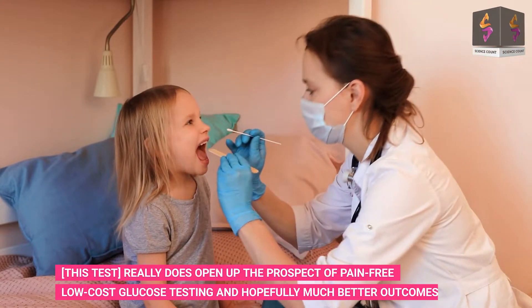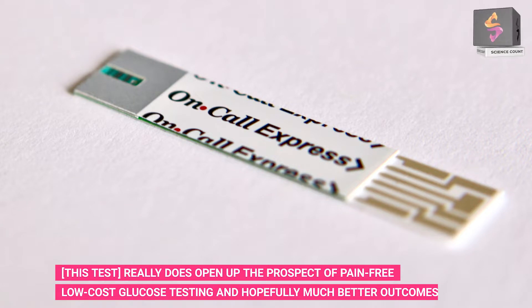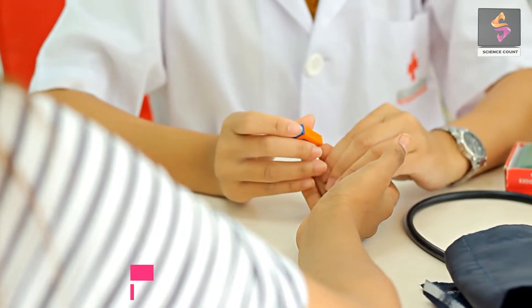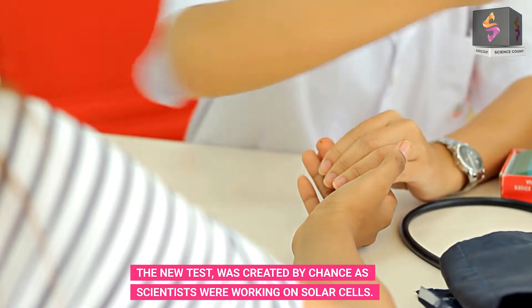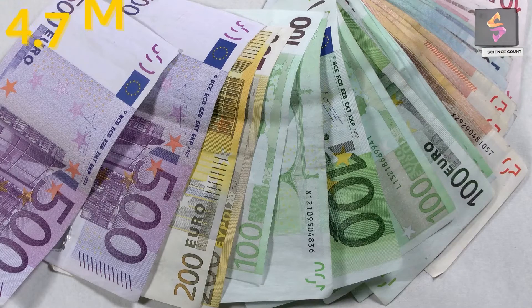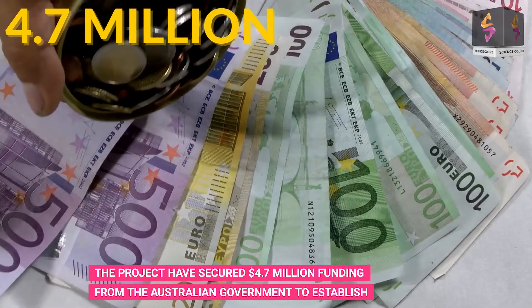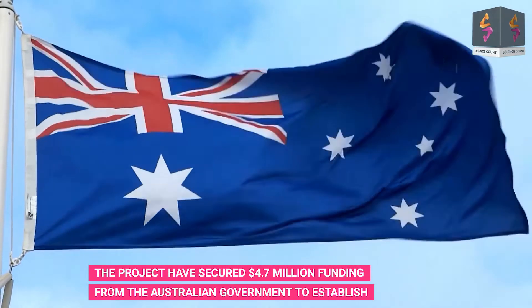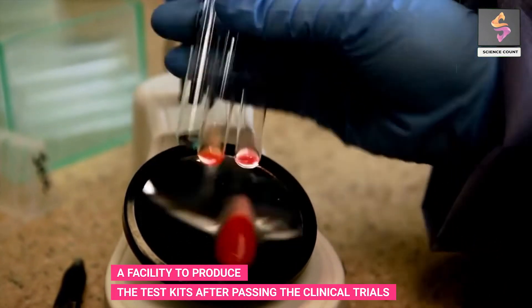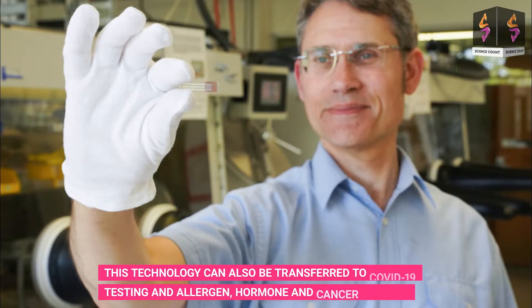This test really does open up the prospect of pain-free, low-cost glucose testing and hopefully much better outcomes for diabetes sufferers. Interestingly, the new test was created by chance as scientists were working on solar cells. The project has secured $4.7 million in funding from the Australian government to establish a facility to produce the test kits.